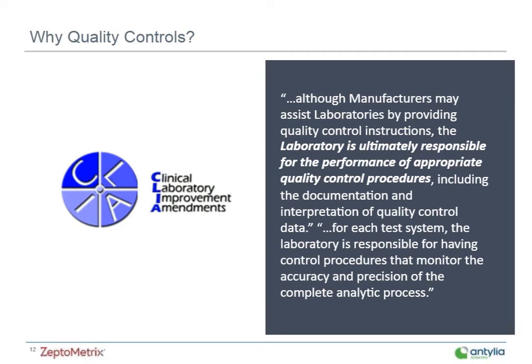And they go on further to say that for each test system, the laboratory is responsible for having control procedures that monitor the accuracy and precision of the complete analytic process. That again brings us back to external quality controls.